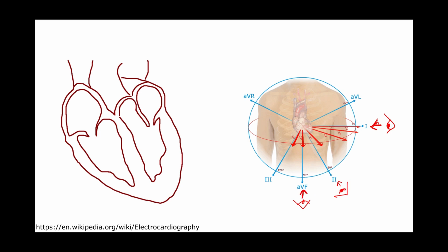Now, if we imagine that we are looking at ventricular depolarization from these leads, we would expect these leads to see the ventricular depolarization very clearly because they're all within the normal axis of the heart where the normal ventricular depolarization travels. Therefore, in a normal axis, we usually expect all three of these leads to show very positive QRS complexes. I'll repeat these statements just so they're more understandable and easier to digest.